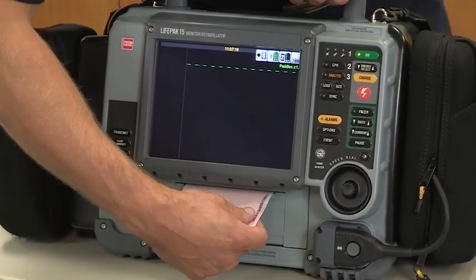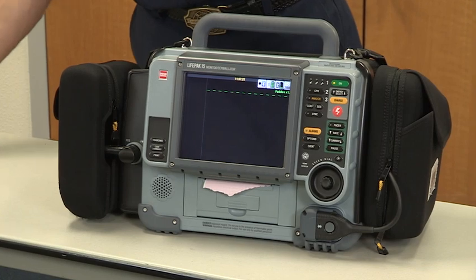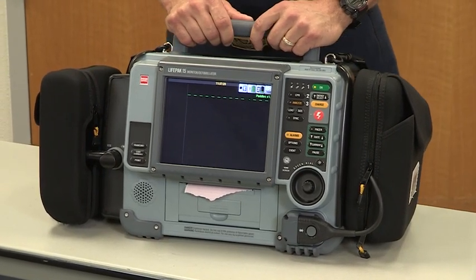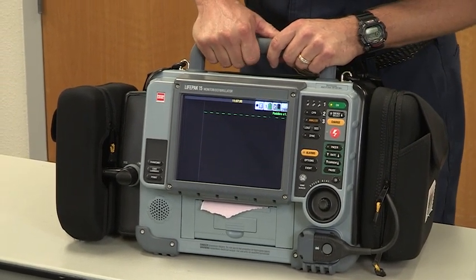Again, just like you're used to now, the user test will print out that says user test passed with the date and time on it. Simply attach that to your clipboard, your sign-off sheet, with the self-test from the LIFEPAK 15 that printed out 0300, and you're good to go.